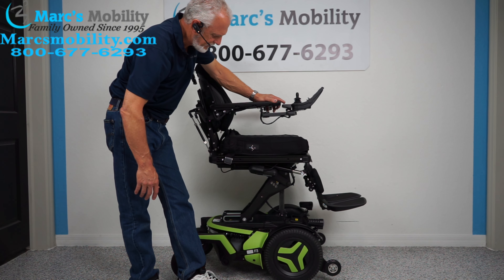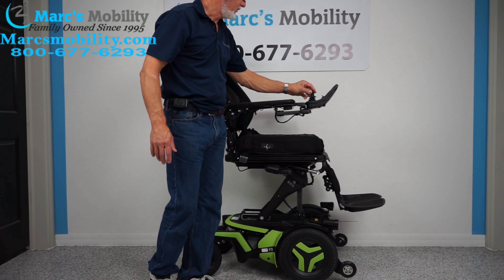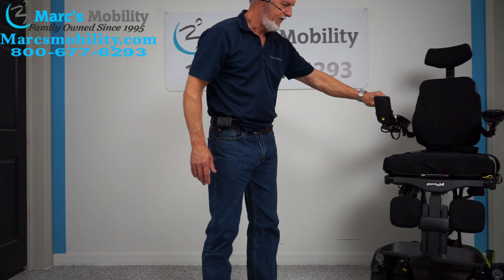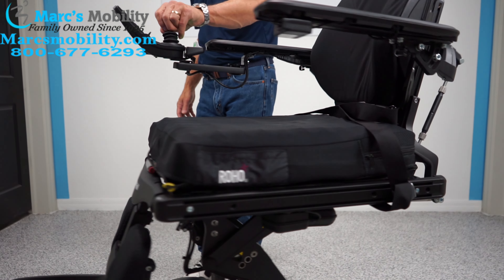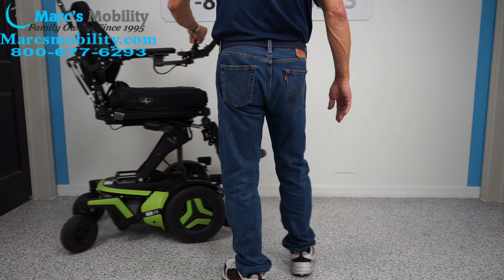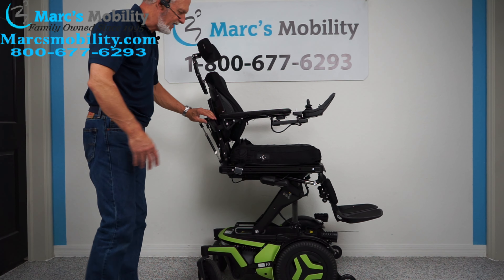We're almost all the way up — 12 inches — and we're going to put it back in drive so you'll be able to see. We don't have a lot of room in this 12 by 12 room here, but you can see how fast it goes. So the seat is elevated right there.